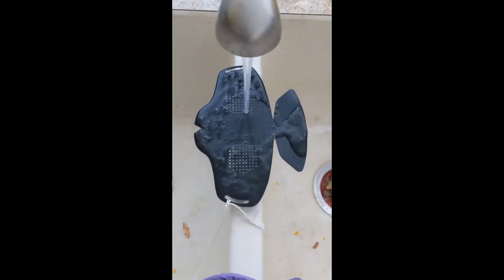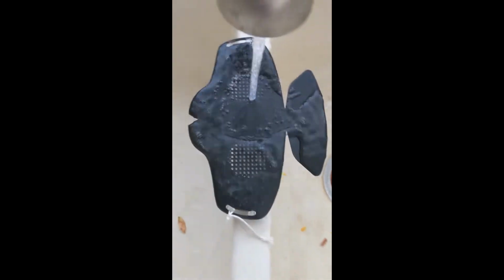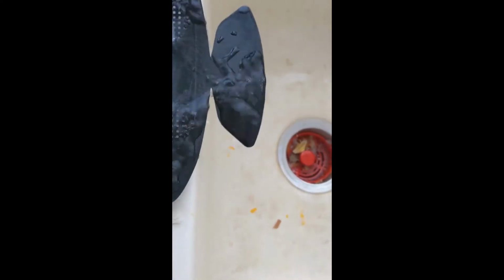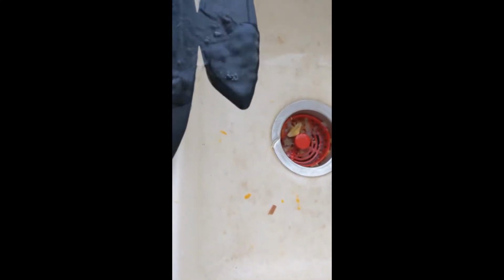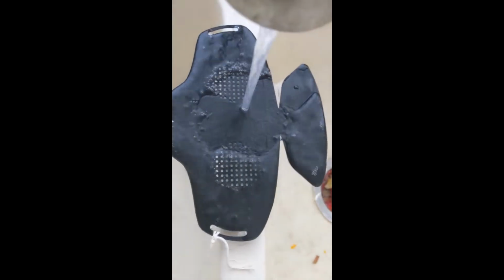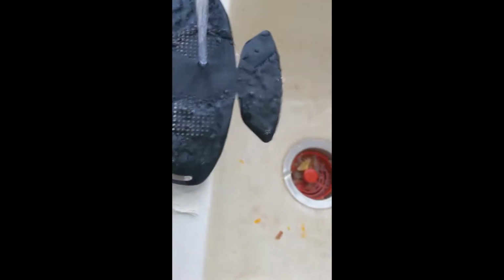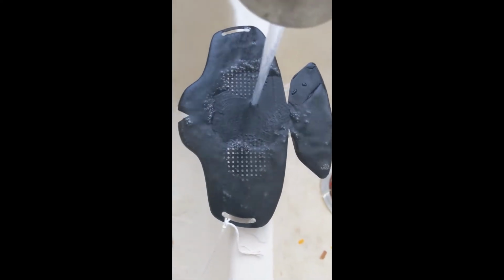So, part two of this video, I'm going to try thermoforming the Copper3D mask to my face. Just pouring hot water, and this is PLA, so it is already pre-bending. So I'm just going to let it soak in hot water for a minute, and then thermoform it to my face. And I'm just going to use some string right now for putting it on. Make sure you wash it off in case you got any glue residue or anything on it.